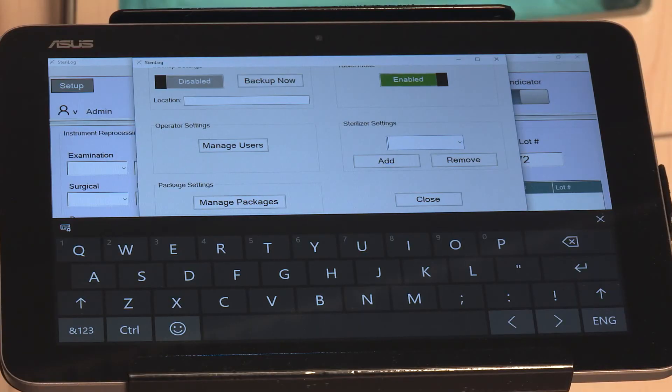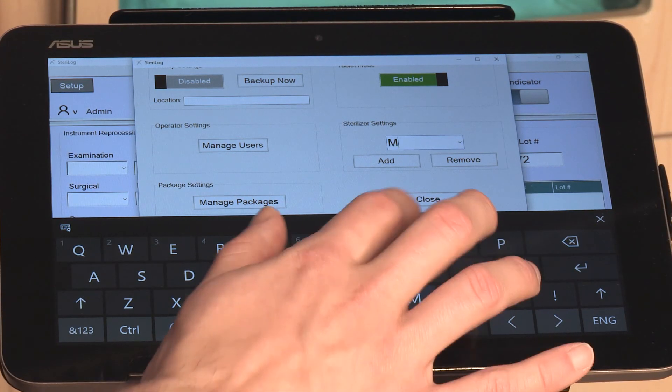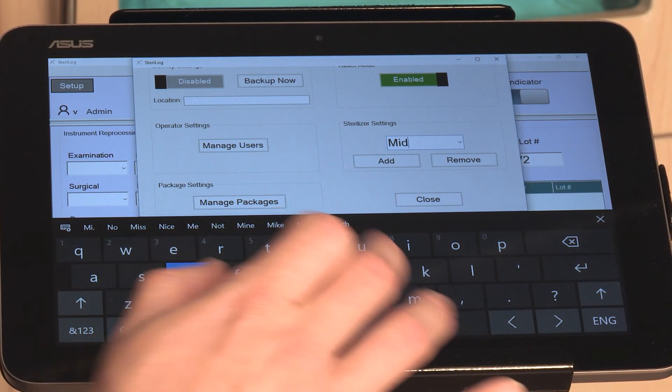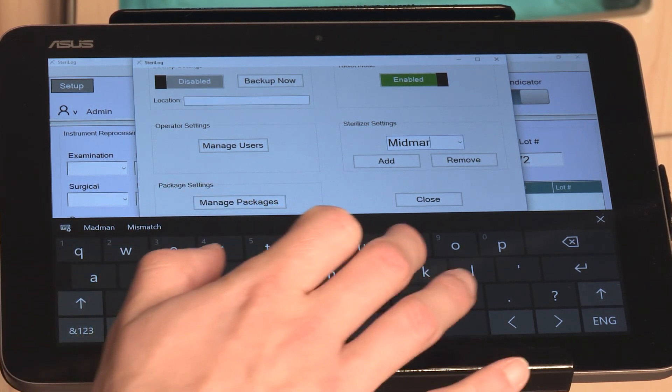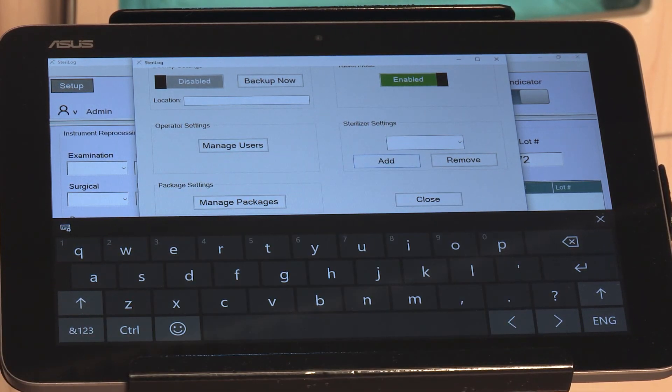To add another sterilizer, so say Midmark, you would just key it in and again hit Add.